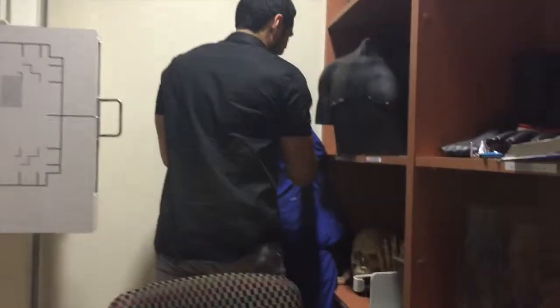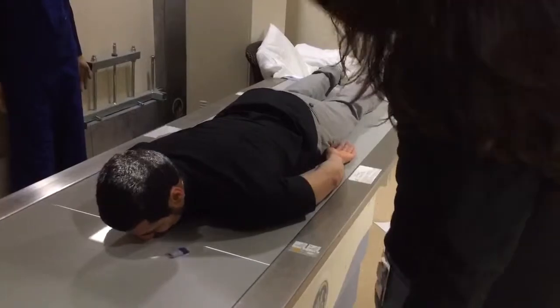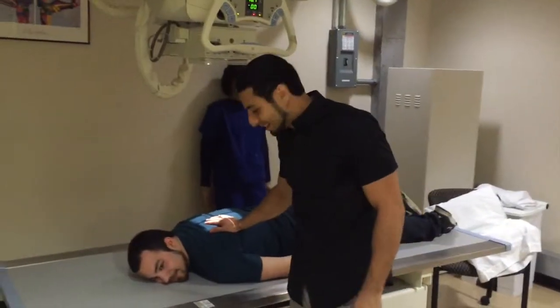This isn't gonna work. Not gonna work. Don't forget to put the marker. I'm all set. On my friend Lad here.